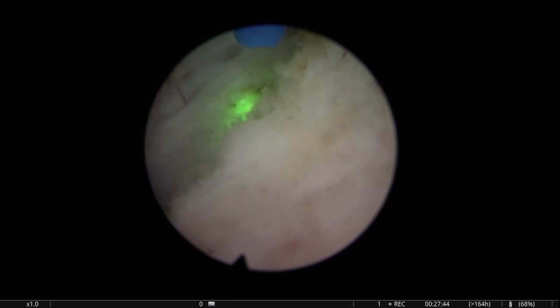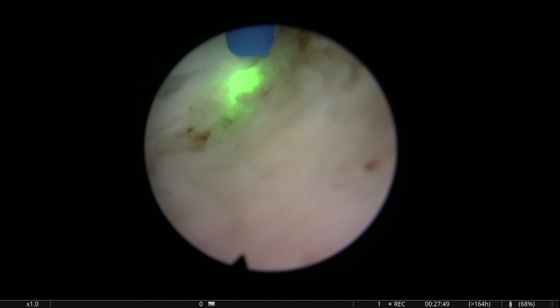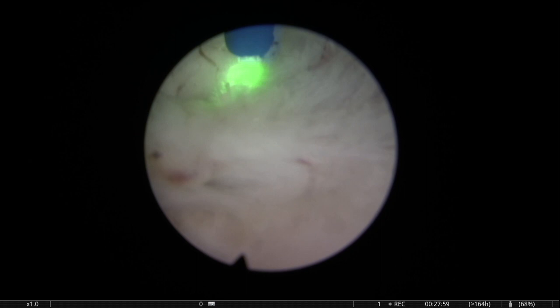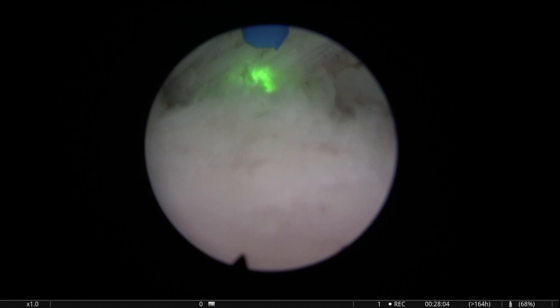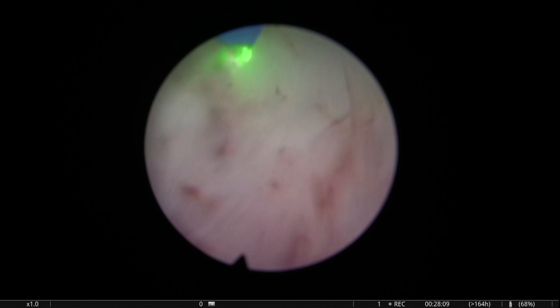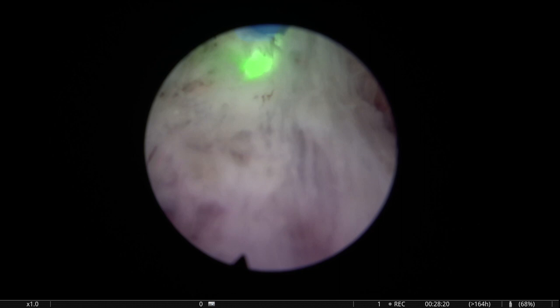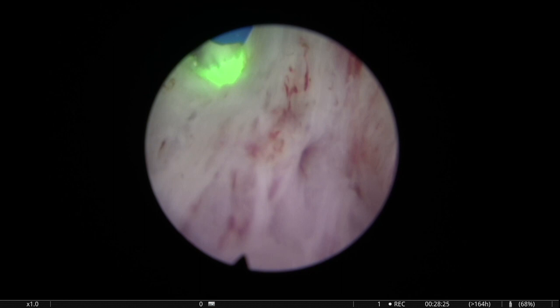If you are careful and you don't do crazy movements or crazy cutting, or you don't want to rush it too much, then you're going to be okay. So it is a combination of skills: the skill to position the fiber where you want, the ability to predict what the energy is going to do in the tissue to dissect the plane, and the understanding of the anatomical information you're getting from what you're seeing, the look of the plane, the color, the consistency, the presence of fibers. The direction of these fibers is also going to tell you a lot.